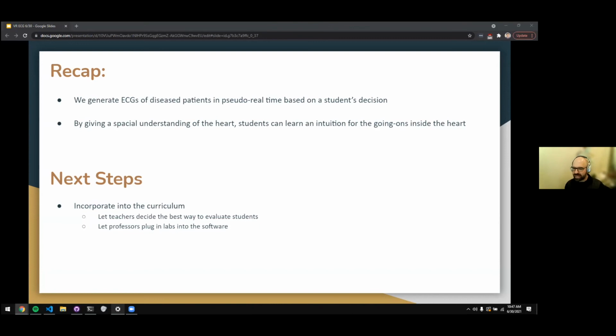There were a couple that we maybe skipped. One question, does the VR simulator have the ability to change body fat and/or gender? And if so, would that also affect the readout? So as of now, the crux of this application is the depolarization vector, and the leads, they generate the ECG. Changing the actual person model inside the application isn't going to do much because the data is kind of pre-processed into the depolarization vector.